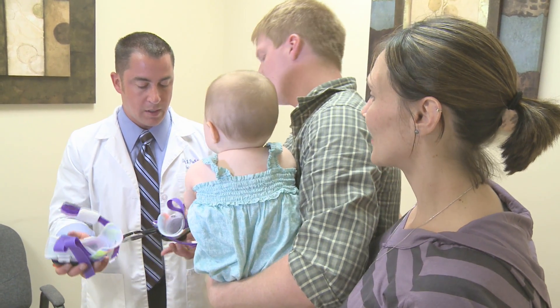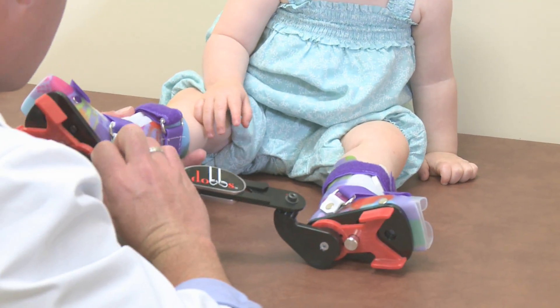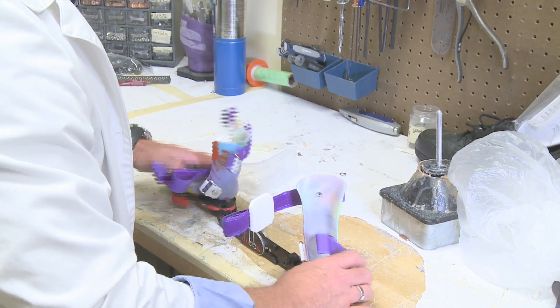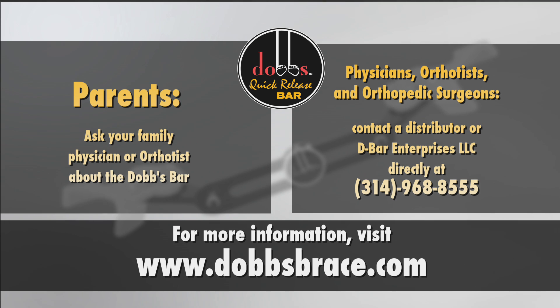Getting fitted for a Dobbs Bar is a quick and easy process. With the doctor's recommendation, the child is orthotist measured, with fabrications coming back in 10 days or less. The Dobbs Bar — the orthotic device that enhances clinical efficiency in the improvement of children with clubfeet.